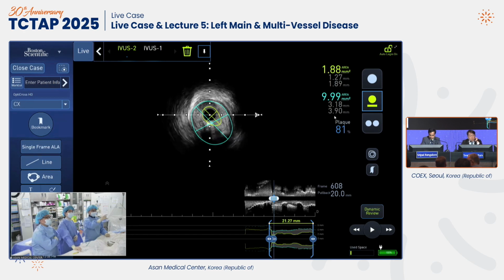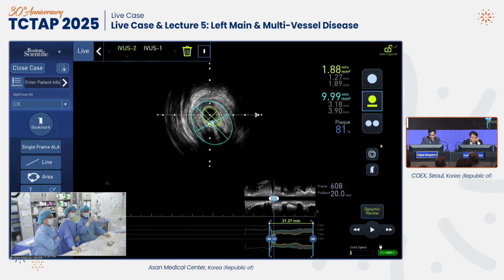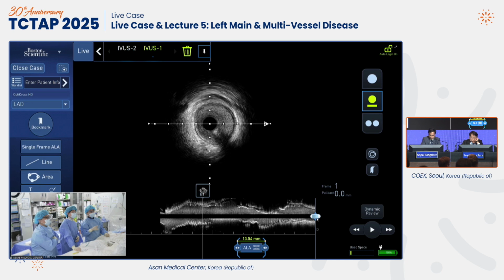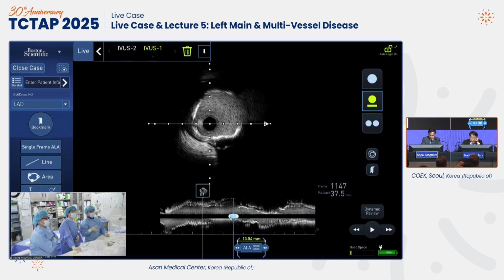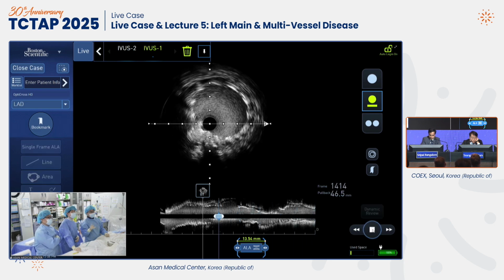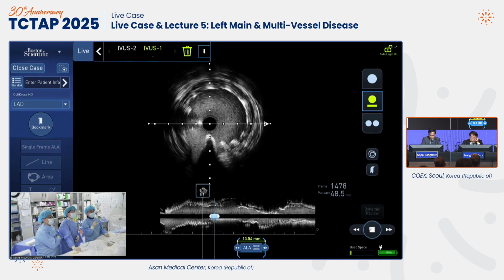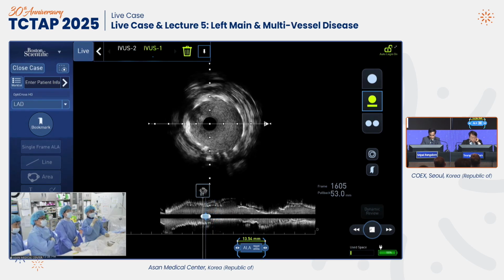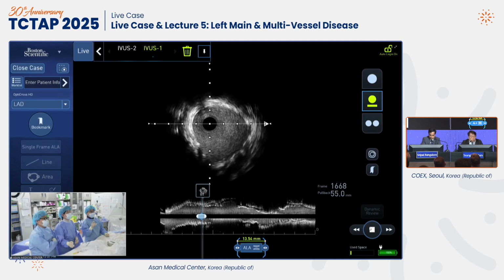Yes. Also, we measured the LAD to the left main. Could you show the part of the circumflex ostium coming? The left main stent was very well expanded. In some distal parts there is some aneurysmal change, but it is very well apposed. The prior stent is well expanded.